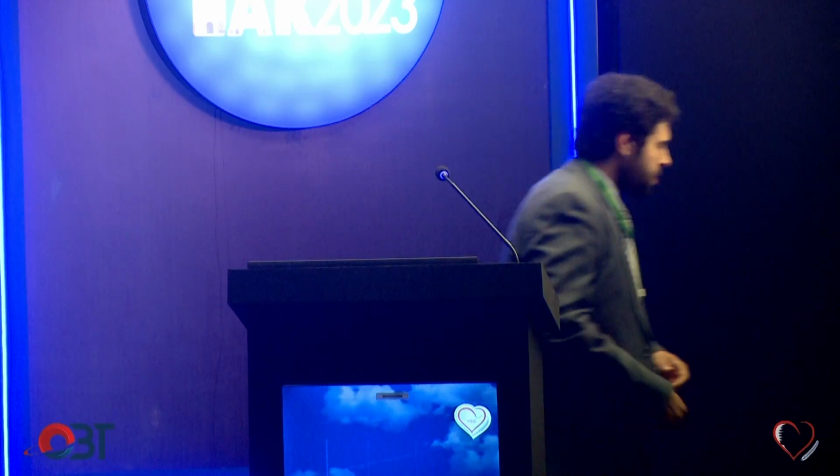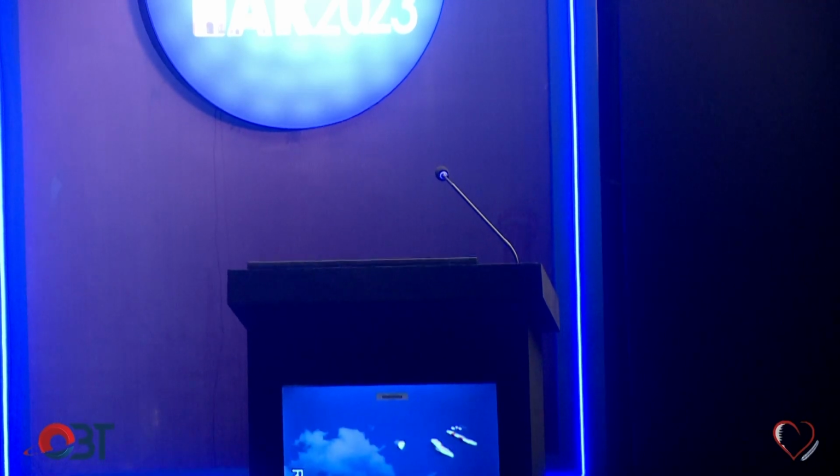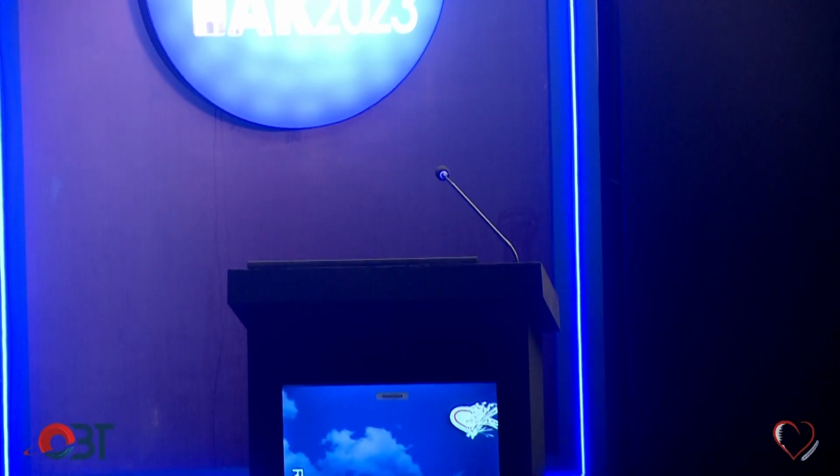Have we done the jail side branch balloon technique yet? Have we presented that? No. Because that would have been a useful thing in this case. What do you think?